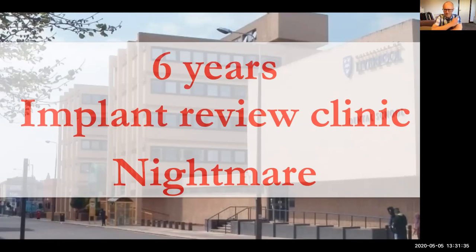So there are massive issues with implants, and they're not easy to do, and I can get myself into so many problems with them, but doing this was a massive help to me. And this is where I started to make things much more simple. So if we had complicated beams and bars, I would take them apart and put locators in, and it just simplified that whole process and made everything much easier.